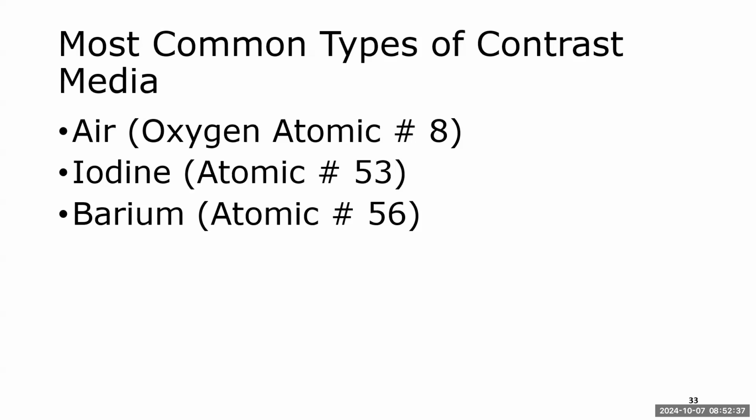It goes into the bloodstream, and immediately within a minute, generally you can start to make out the nephrogram or the shadows of the kidney. And then within 3 minutes, generally you can see the collecting system. By 7 minutes, in a normally functioning urinary system, you can usually see the ureters all the way down to the bladder. That's pretty incredible.